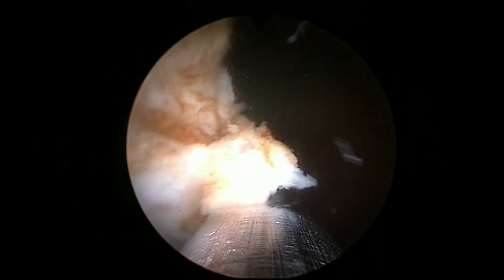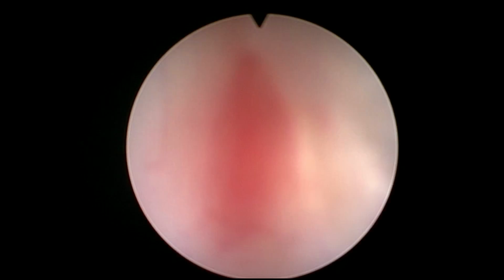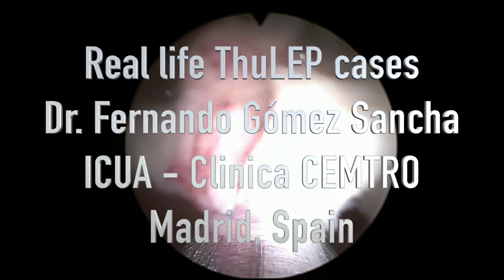So we now have better lasers, better morcellators, and of course the en bloc technique that allows you to progress very, very nicely, very fast, as well as protecting the sphincter so that temporary incontinence is no longer a concern. We don't tell the patients that we have to expect a high possibility of incontinence. We don't do pelvic exercises. We don't do anything like that. And this first evaluation of this laser is very, very intriguing, very satisfactory.